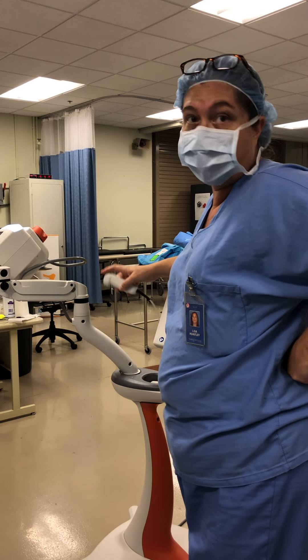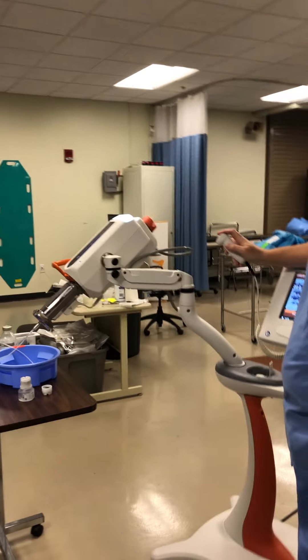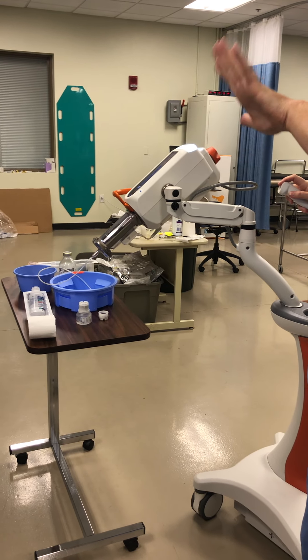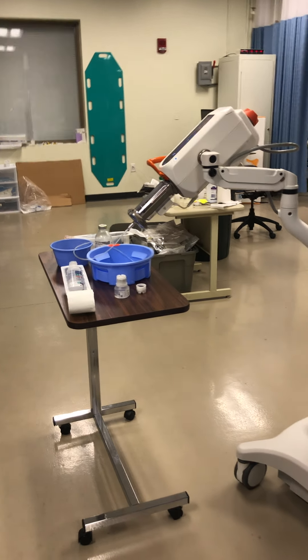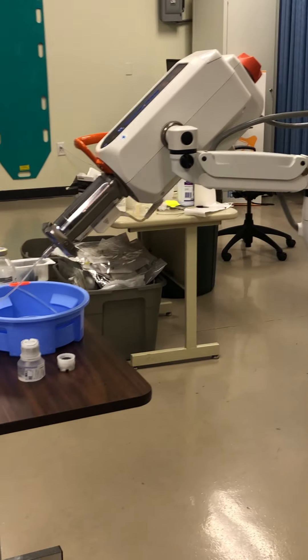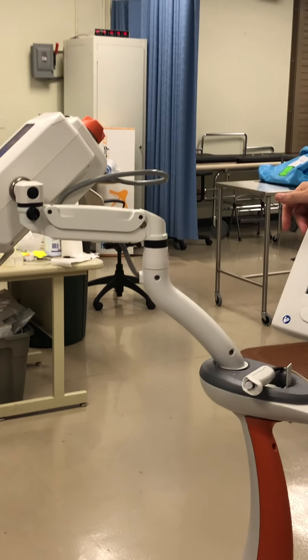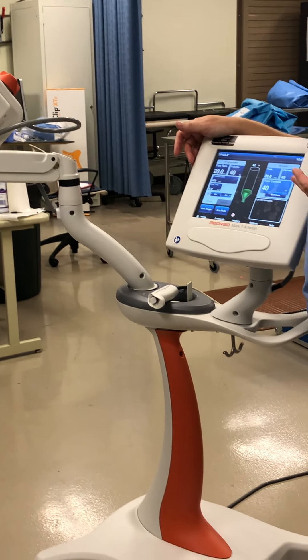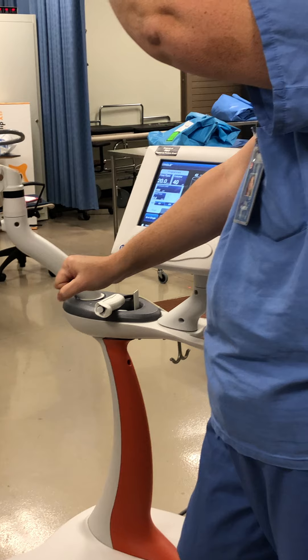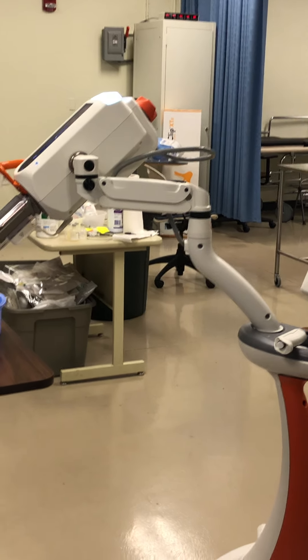I actually hold it down longer. Doctor tells the patient don't move, don't breathe. They step on the pedal for the DSA, the screen goes white, I say 'injecting,' push the button. You hear the beep, the light has gone off, then I release the button — that injection is complete. If I wanted to do another injection with the same program, I would just hit arm again. It's not because we haven't tilted the head back up. If I do arm it again, it's not going to ask me about expelling the air this time, because I've already told it that I did expel the air.